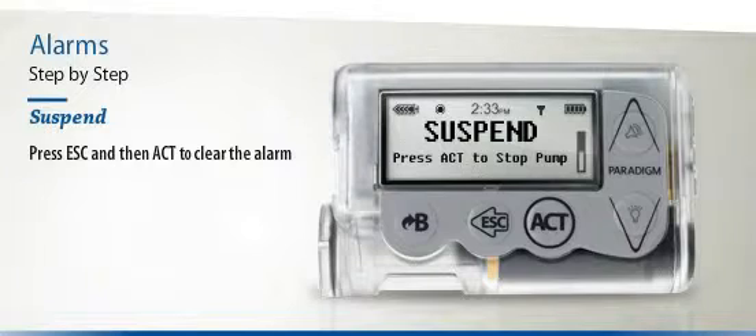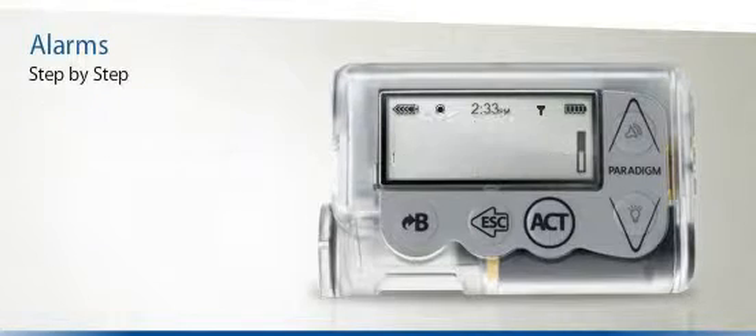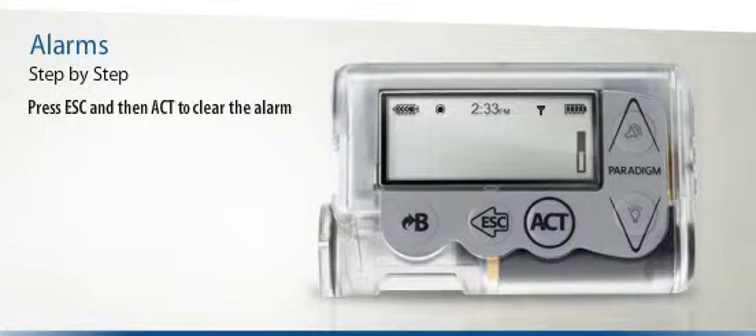Suspend: press Act to stop all insulin delivery — basal, bolus, as well as fill cannula. If you are in the process of administering a bolus when you suspend the pump, you will not receive the entire bolus. To clear the alarm sound and vibration for all of these alarms, press Escape and then Act.